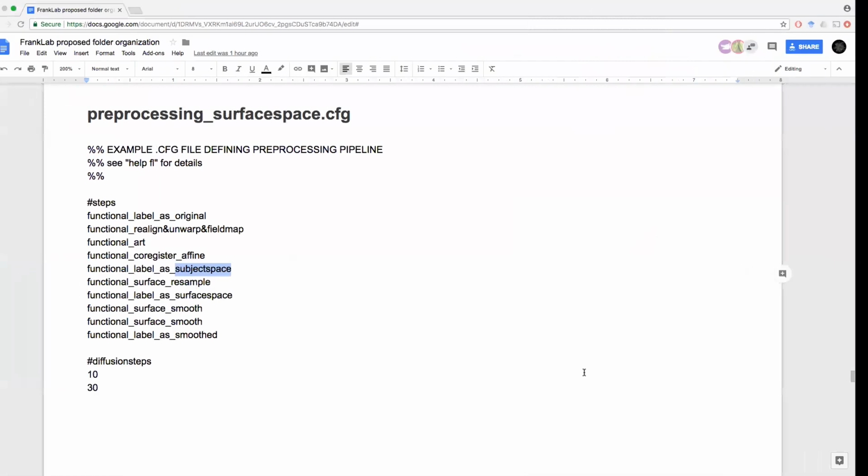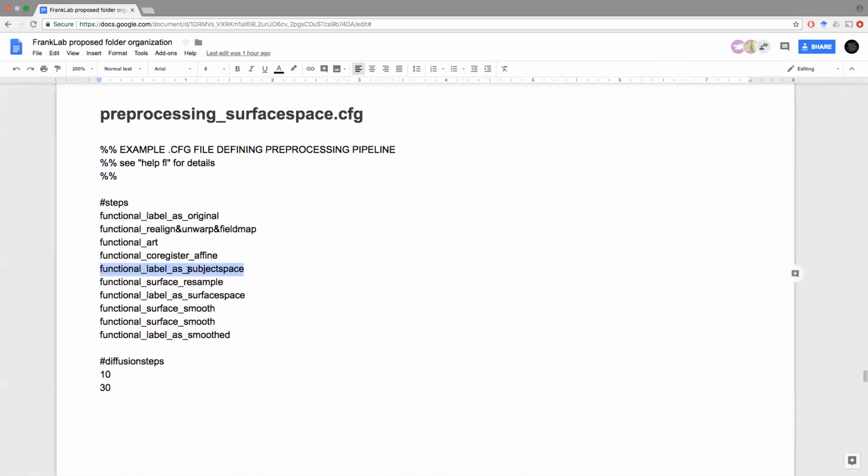Okay. So, any additional questions about this resampling? Is that clear enough? No, I think that's totally clear now. Okay. I should have pretty pictures to kind of explain this. It's all very difficult to explain conceptually, but anyway.